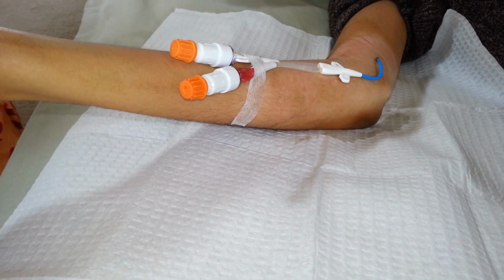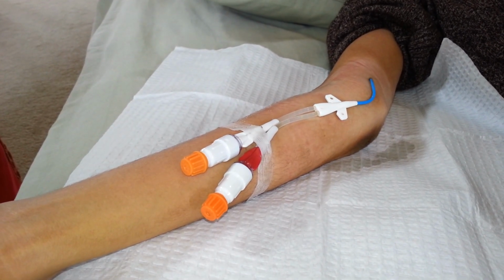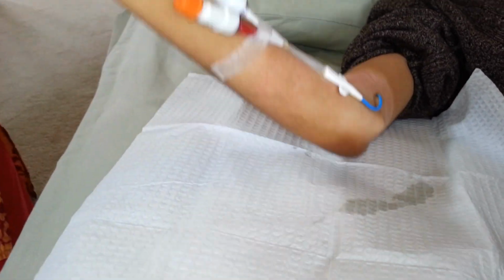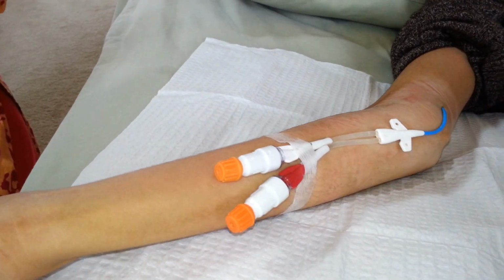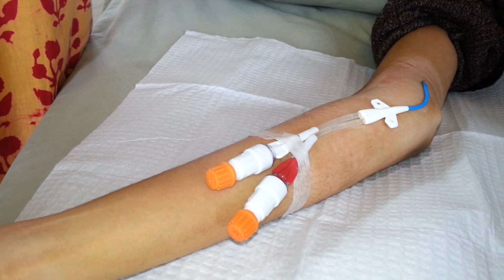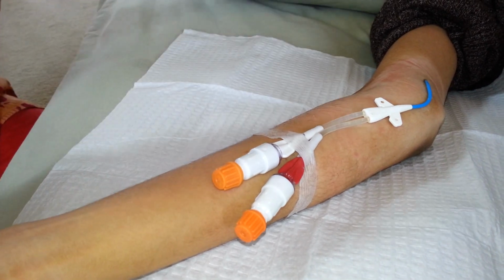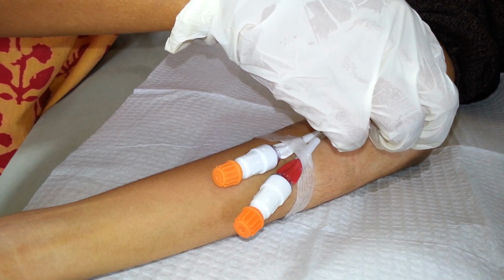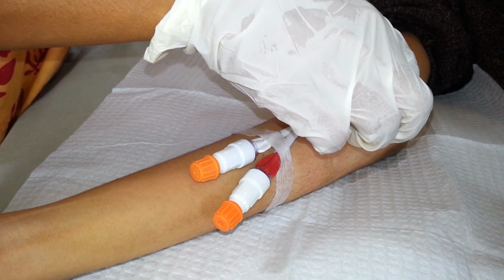Now we will let it air dry for a few seconds. Air drying means not to blow on the site or use a fan, just let it dry out itself. We can gently touch on the skin to make sure it is dry. We are just holding the wing so it dries out from underneath.